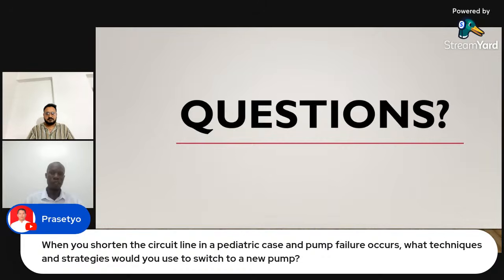Also, if I have worked well in my preparation, I don't expect it to happen when the case is going on. Though it can happen, in case of pump failure, there's a way we are going to work on that by use of the crank, right? In case the pump fails to function.